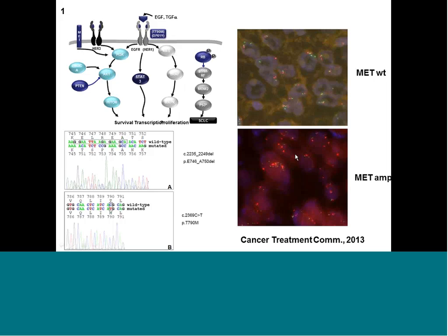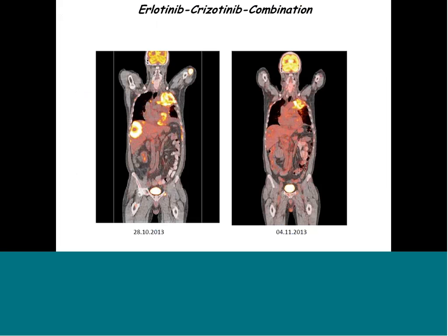And you can see in the third biopsy, we see in the red signals this massive amplification in c-MET, which was not present in the previous biopsy where only the T790M resistance mutation was present. So it is very important to monitor patients and ask the question, is my therapy still effective, or do I see emergence of resistance? And of course, today, this patient would be treatable.